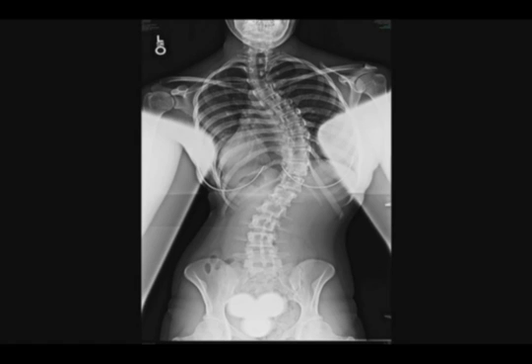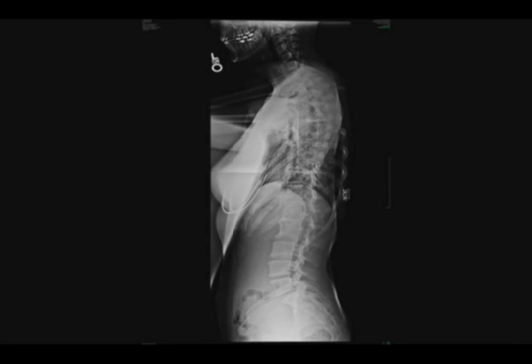This is Baron Lonner. I'm a surgeon at NYU Hospital for Joint Diseases, presenting a surgical case of adolescent idiopathic scoliosis treated from a posterior approach with pedicle screws. This is an adolescent girl who has a large progressive thoracic idiopathic scoliosis.